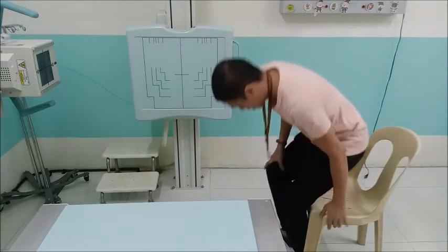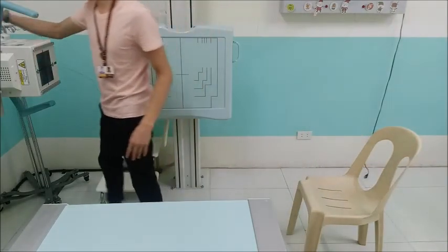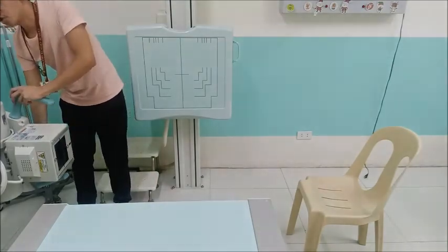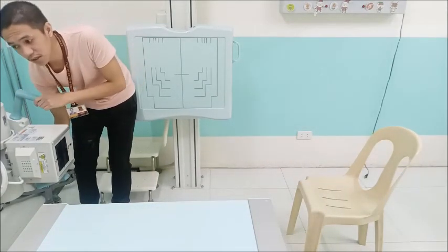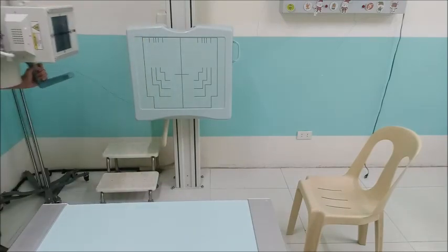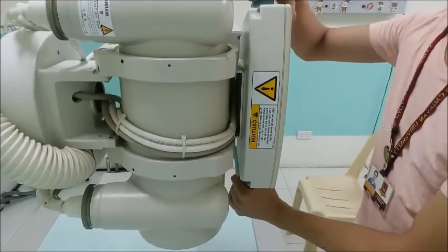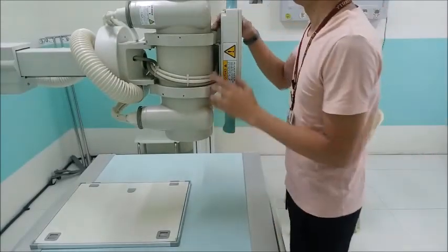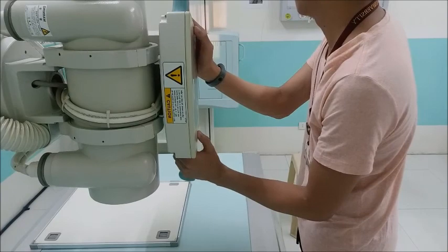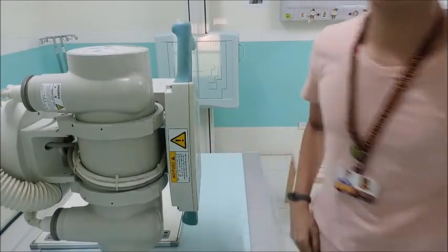So you have the chest stand, you have the X-ray tube, and then you will have your patient sitting here. So the bucky can no longer be used. This time, the X-ray tube can be pulled out up to this portion. It cannot be pushed further towards the ground because of the limitations of the connection of your wire.